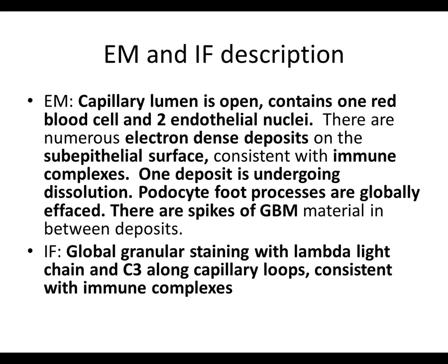Yeah, we see that a lot. I didn't put it in my description. We hit on so many things where podocytes are injured, but that would be another thing that is definitely there, and it's prominent in this case. So everybody saw the little cytoplasmic projections on the EM picture coming off the podocyte. And we see that a lot in podocyte injury, and it's a very nonspecific change.